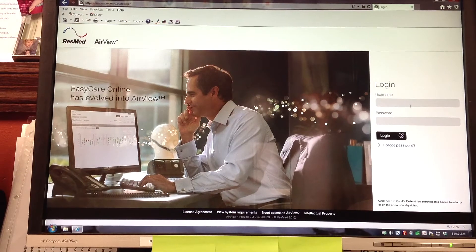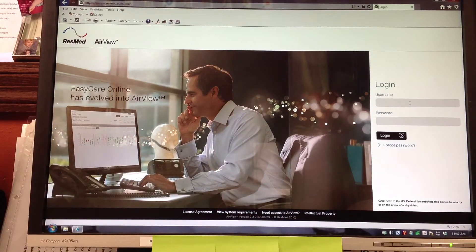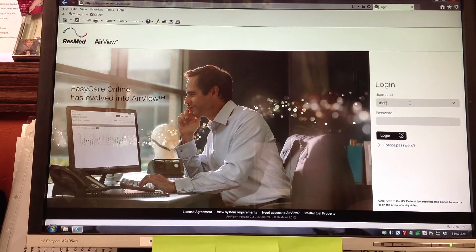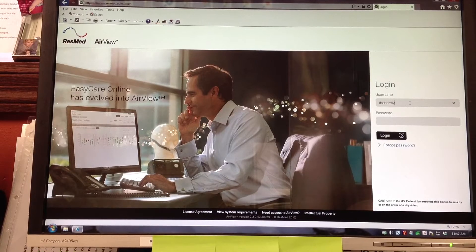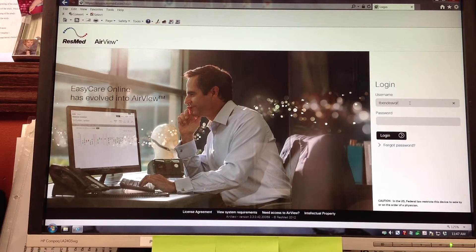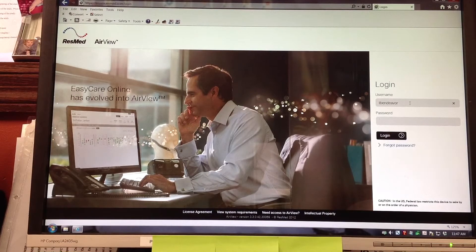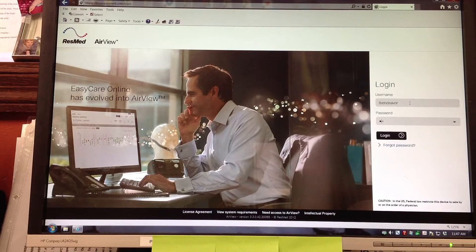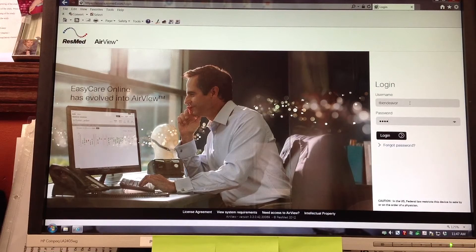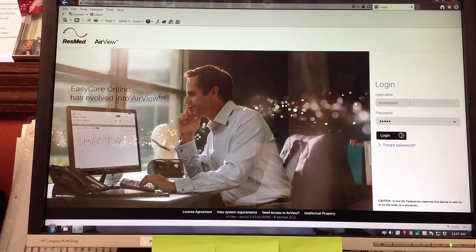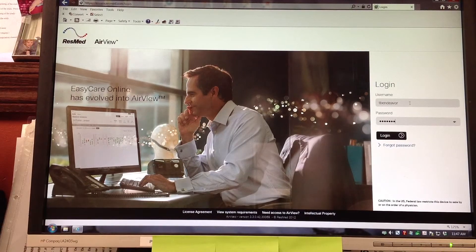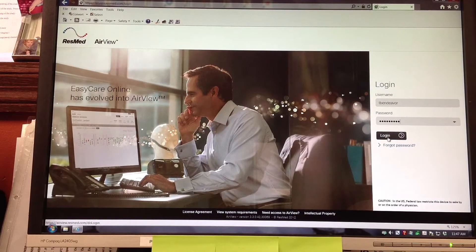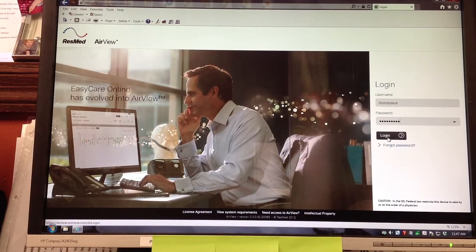Now she's going over to the login. You will be putting your assigned username and assigned password into the system. Every clinical user at every QuadMed clinic will have an assigned username and assigned password. Next she's going to click login.